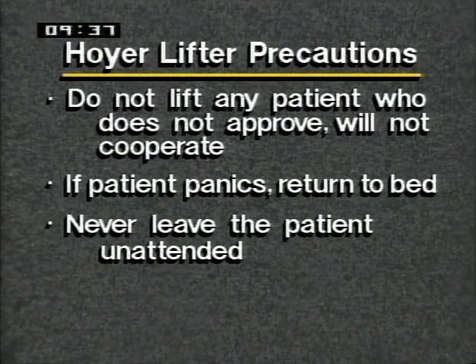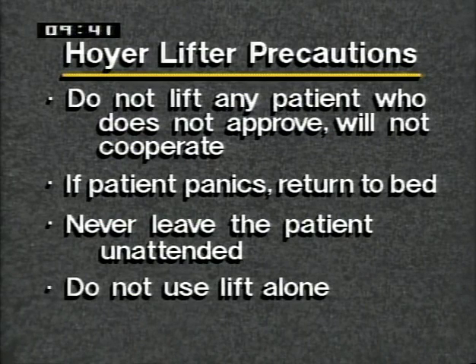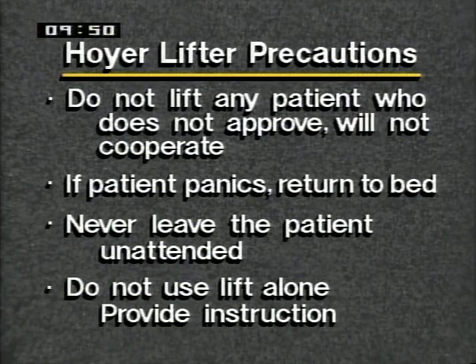Never leave the patient unattended once you have started the transfer. If possible, don't use the lift alone. It's best to have someone available to assist you with the procedure. The person assisting, if not experienced in the use of the lift, should do only as instructed by you.